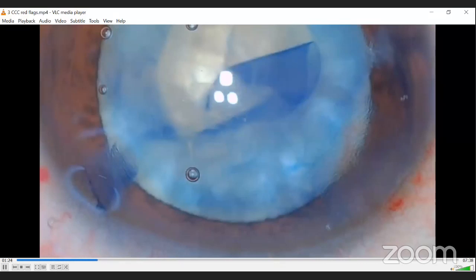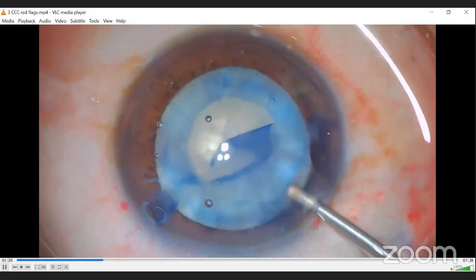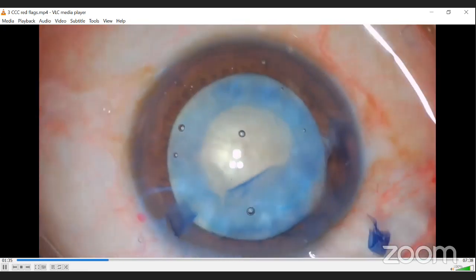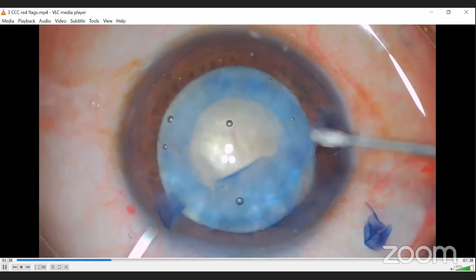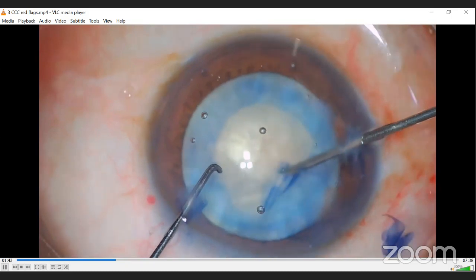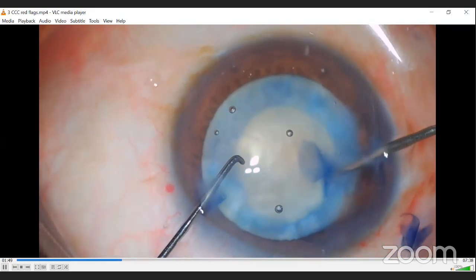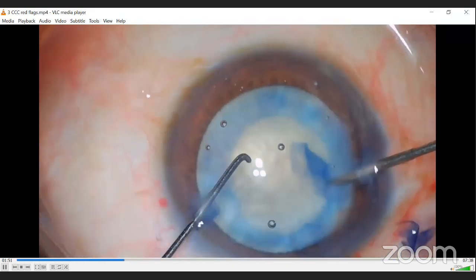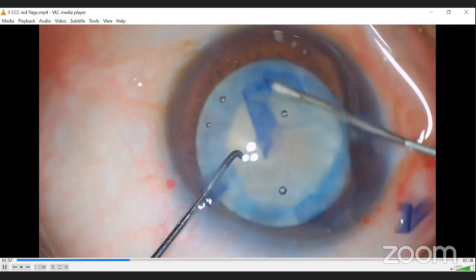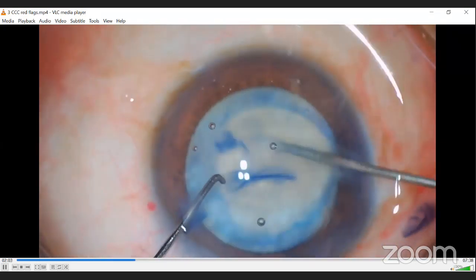Once you see it, you have to immediately stop and then replenish the anterior chamber with good viscoelastic agent. Though we are far away from the zonular area, we don't want the direction to go that way. So it is better to prevent it from going that way. So now I have again deepened the anterior chamber a little bit. And now I'm pulling the Capsulorhexis. Now it came in, there was no extension from that side. And I could complete the rhexis easily. So this is a red flag. So we should not miss these red flags so as to achieve safe Capsulorhexis in all cases.